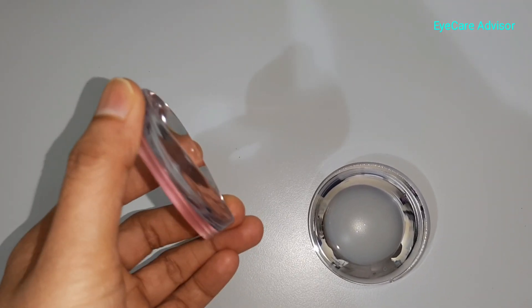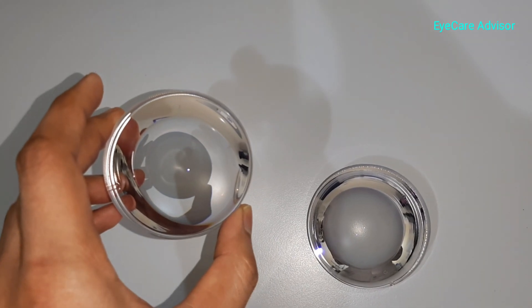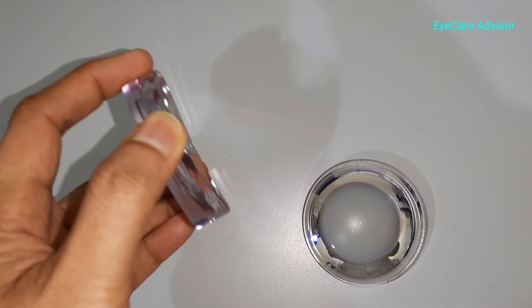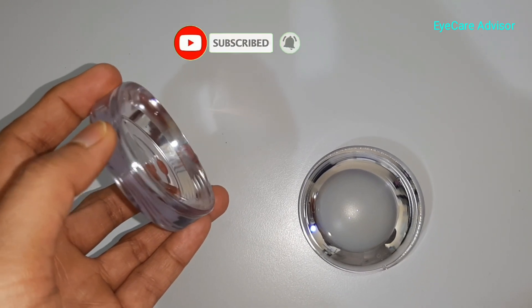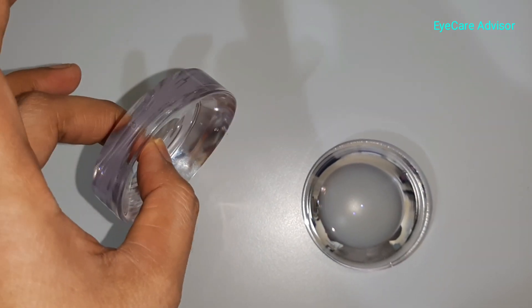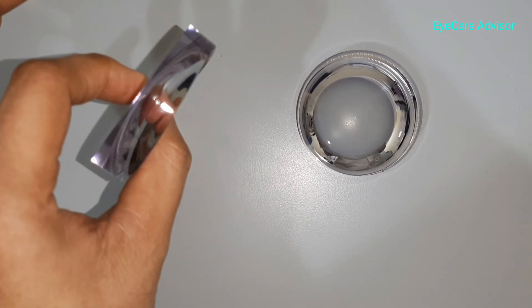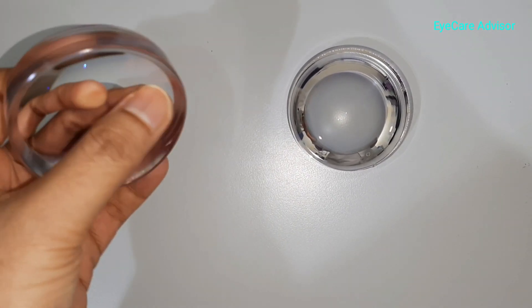You can see the thickness of these lenses. This lens is minus 15 with minus 2.5 astigmatism. Though this is a double aspheric lens, because of the power the side thickness is more. But if I show you the lens by tilting, you can see the inside part is very thin — the central thickness is very very less, though the sides are thicker.